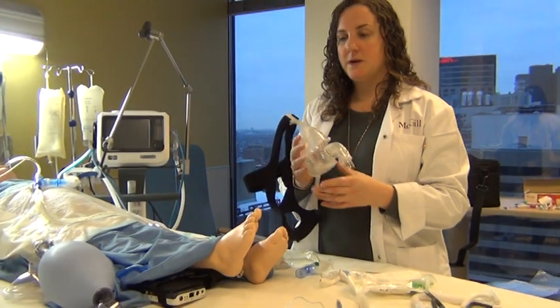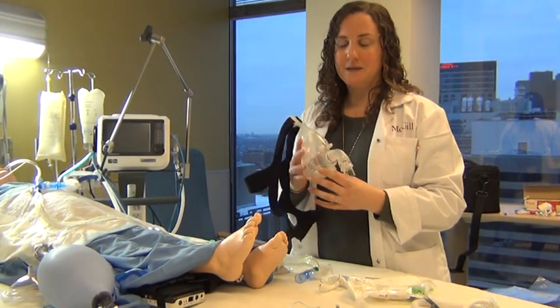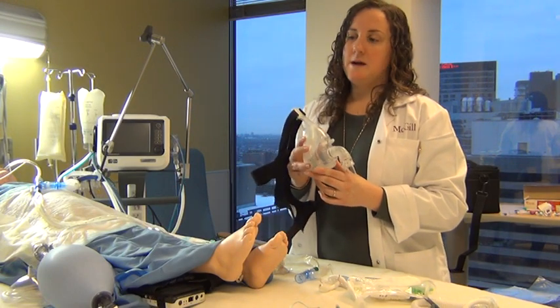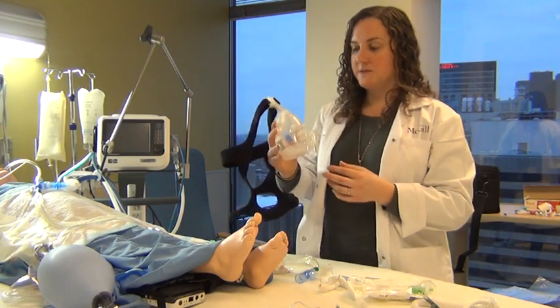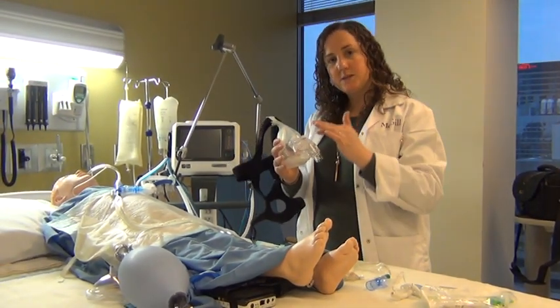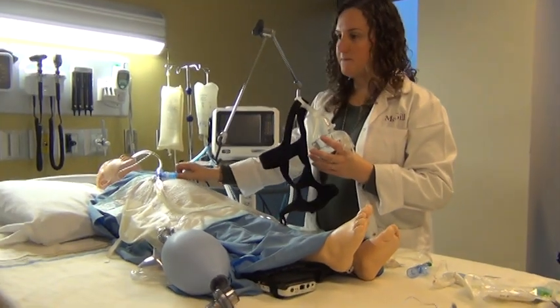And so that there's always a positive pressure, so usually a bilevel, so BiPAP, so bilevel inspiratory positive airway pressure. So it'll have a higher pressure on inspiration, lower pressure on expiration, but it's provided through this device here. You could also have, again, like I said, a CPAP where it's just one continuous pressure, usually not as high as the BiPAP pressures.